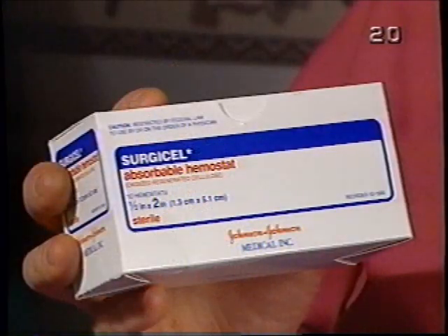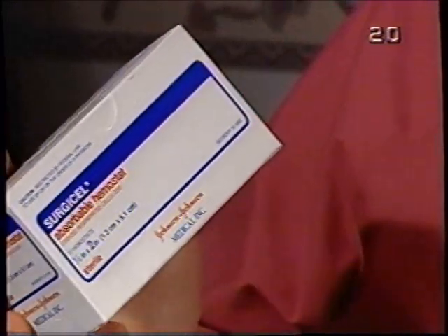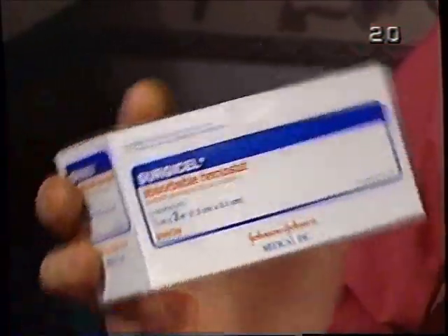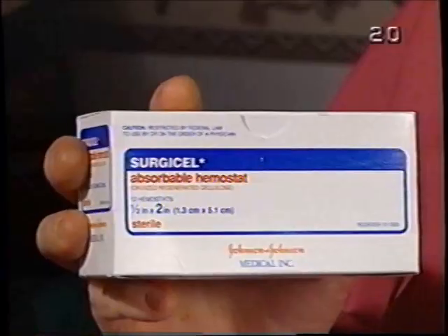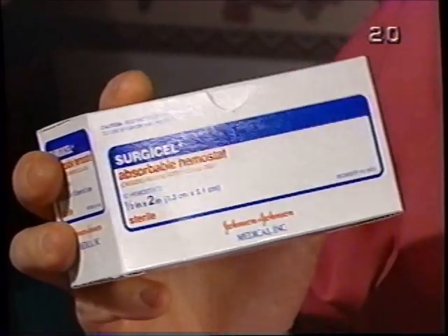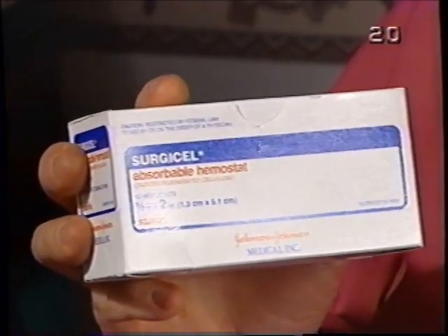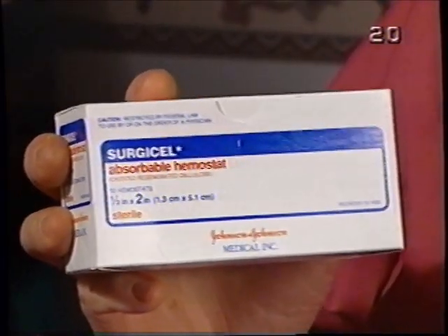Another entity that we might use for bleeding problems, if we have a lot of blood coming from a socket, is Surgicel, which is this hemostatic agent, oxidized regenerated cellulose. To put a small amount in, large amounts generally need to be removed, but small amounts can stay in the socket. We suture over the top of it. And gel foam is something else that you could use as well.